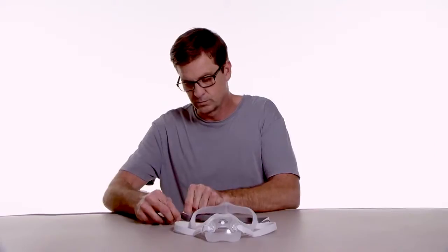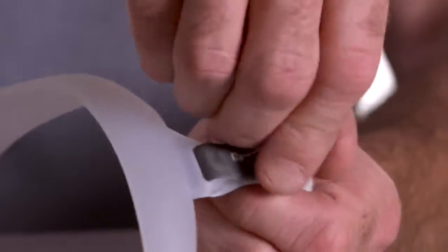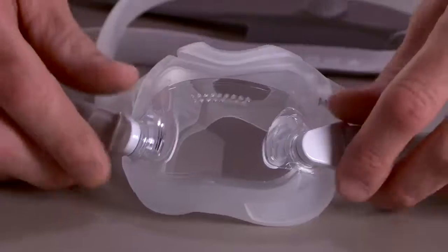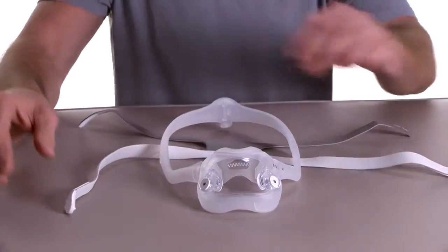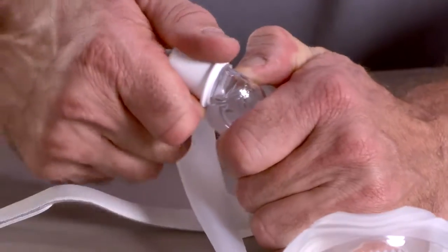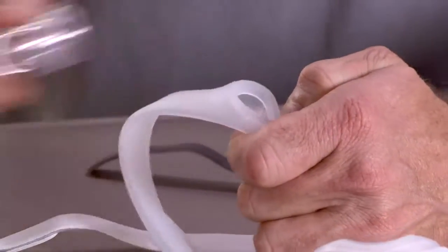To disassemble, release the headgear tabs and pull the straps through the slots in the mask frame. Turn the magnetic headgear clips away from the mask frame. Disconnect the tubing quick release from the elbow. Pull the elbow from the top of the frame.